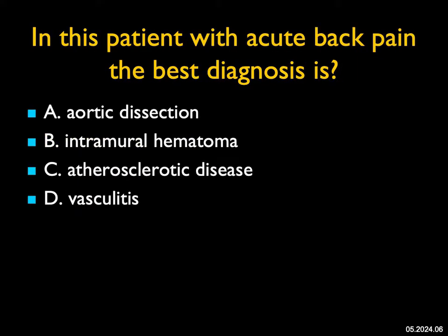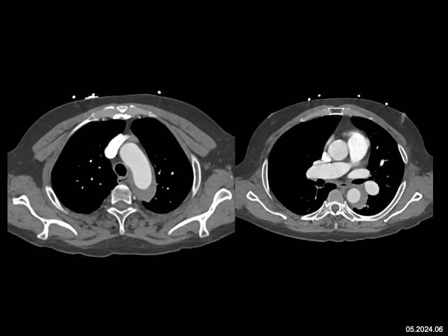In this patient with acute back pain: you can see soft tissue thickening around the arch and descending thoracic aorta. I don't see a dissection flap. This is not classic atherosclerotic disease, where you typically see soft tissue thickening a few millimeters surrounding the vessel, often with calcification — there's no calcification here. You could think of a vasculitis, though I can't really exclude it. Something like Erdheim-Chester disease can give you lots of soft tissue thickening, but it may be more extensive in terms of involvement.